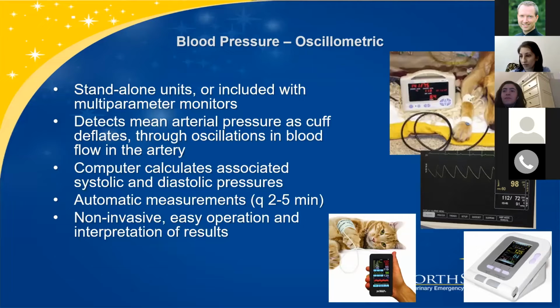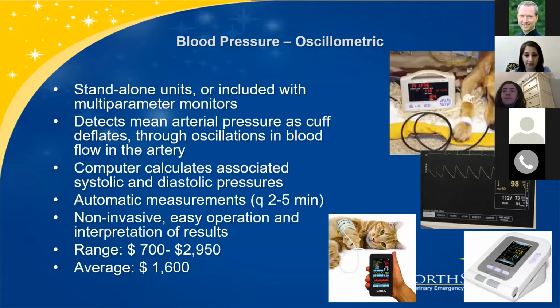And so the cost of these units can vary depending on their quality and the technology used within them. I'll say that I have a cost in there, but in recent years they are becoming a bit more expensive to deal with. Some of the technology has changed. There are a lot of companies making a lot of different monitors, and so they may actually be getting a little bit more expensive than the quotes I was getting probably a year or so ago. So they may be a little bit more.